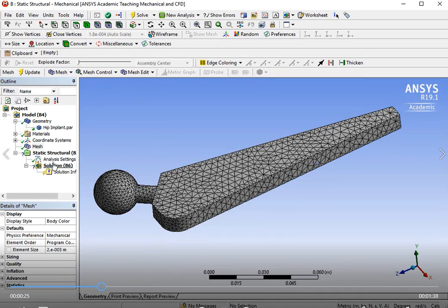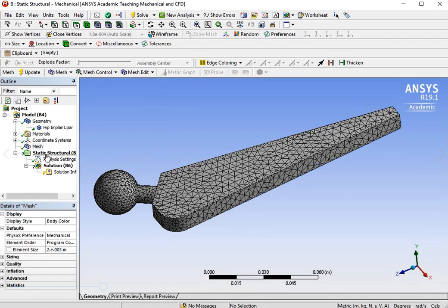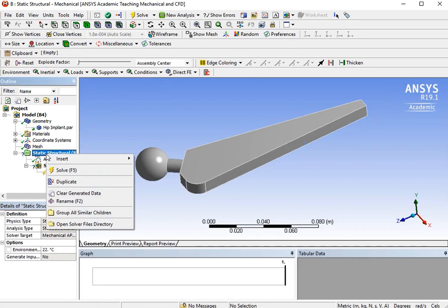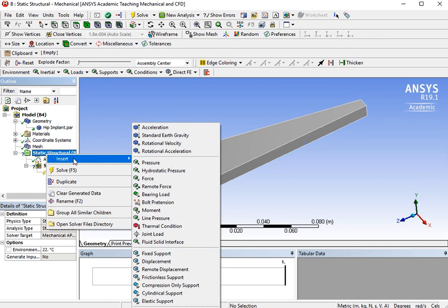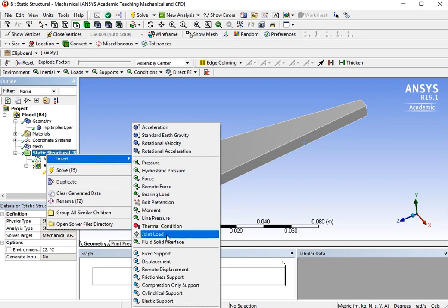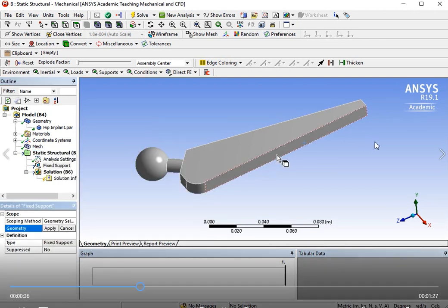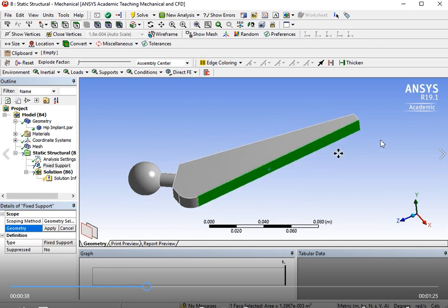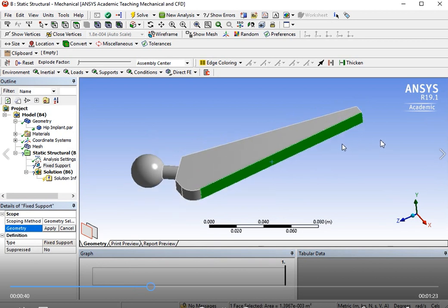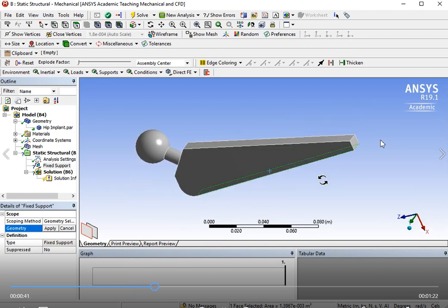The model is meshed. We move on to apply constraints. Right-click and click on Insert, then click on Fix Support. First, just constrain the body part of the implant — click on this area and use the wheel to rotate the model.